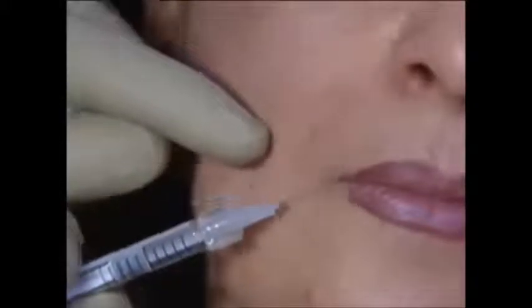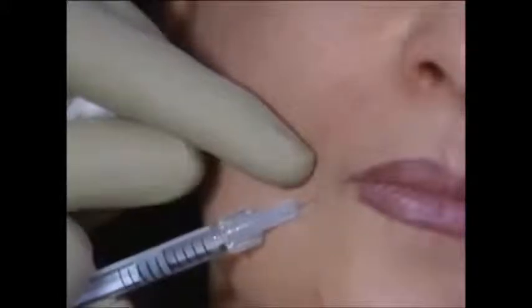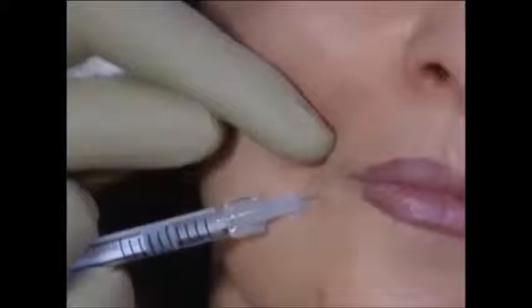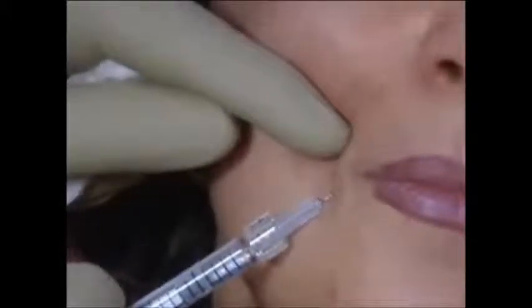At the corner of the mouth, there is generally atrophy in patients as they age, and injections just along the edge of the orbicularis oris muscle can be performed slightly deep. The injection should be performed very gently, not under a lot of pressure, so as to allow tracking under low pressure. Notice the difference between the right side, which has been injected, and the left, which is not, and still has deep folds. There is excellent soft tissue filling and only a mild redness or erythematous reaction.